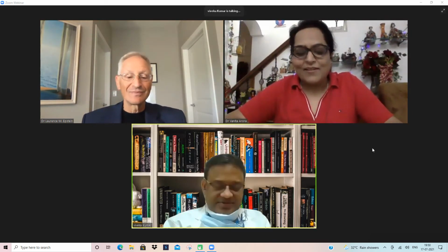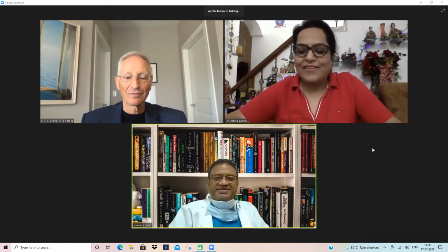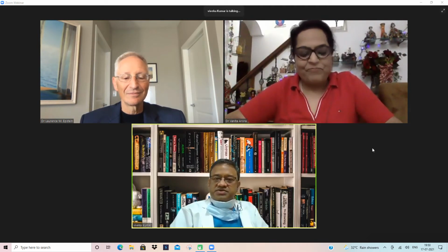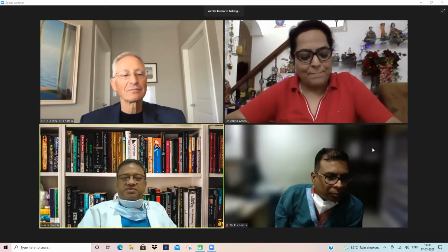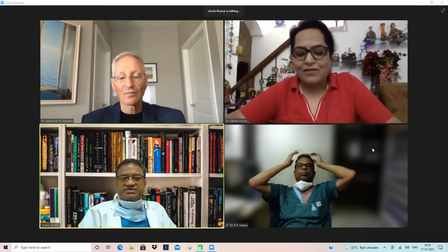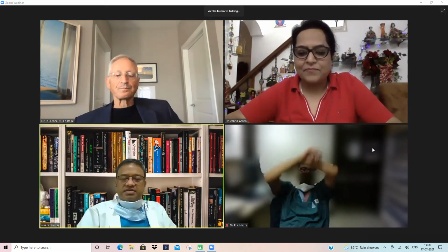Yeah, so I think one which Dr. Lawrence has just shown would be the best situation, that case where you did not have any other option. There are situations where you do not have any other option, like the patient has no access, multiple infections and all those things. So their Micra would come very handy. So that is one situation. I think you and I have put in at least 5-6 patients who had multiple device infections and all.